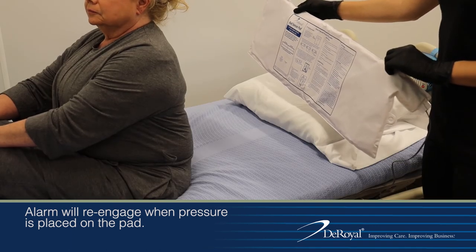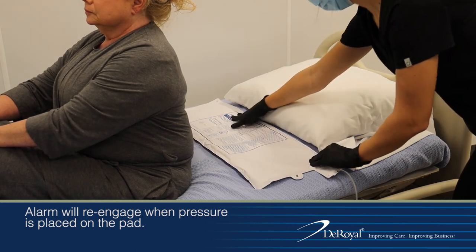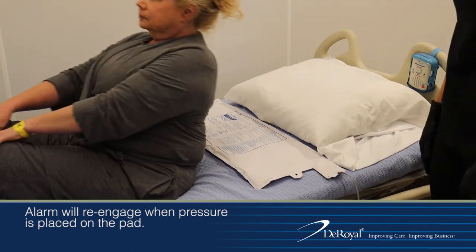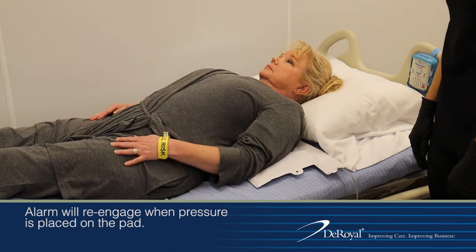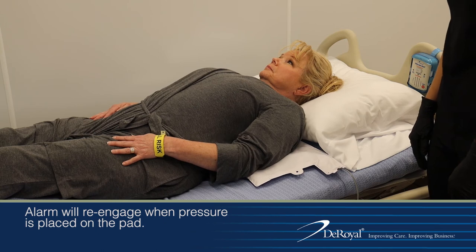When using a monitor with the bed sensor pad, place the sensor pad on the bed under the patient's shoulders to detect early movements. To be notified if a patient is getting up out of bed, place the bed sensor pad on the bed under the patient's hips.